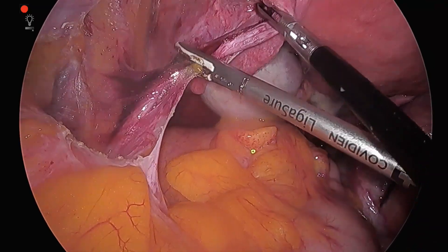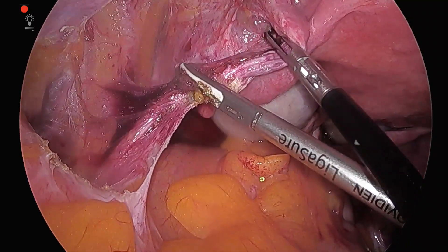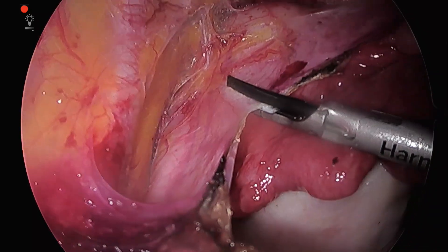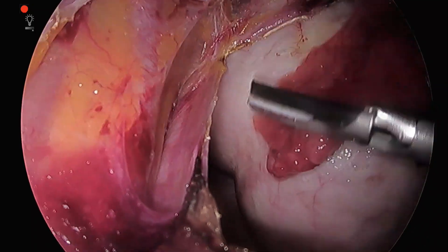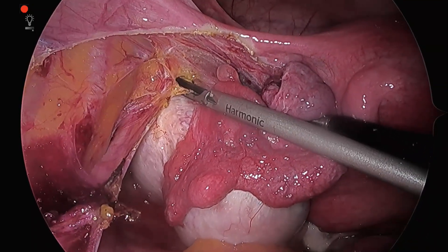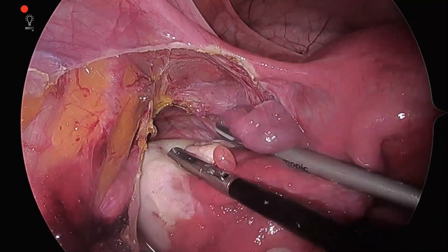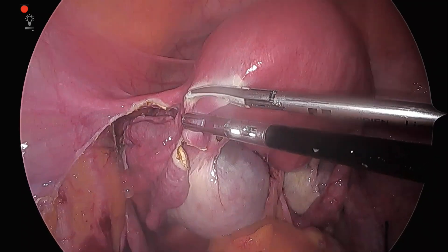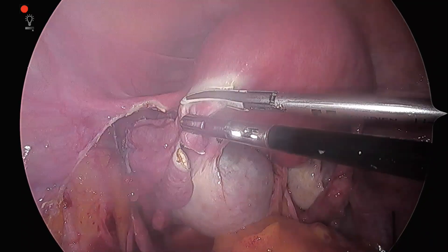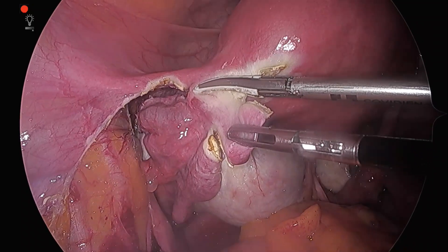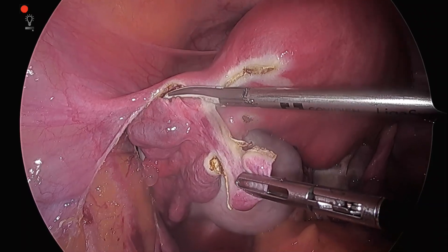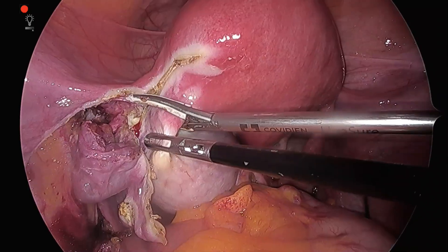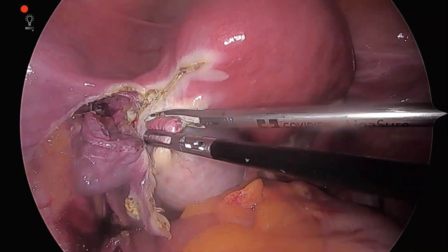Now the infundibulopelvic ligament is taken down with the help of a LigaSure. Since we have visualized the ureter completely, we are cutting the lateral attachments of the cyst. The utero-ovarian ligament is taken down to provide better mobility for the left ovarian cyst.